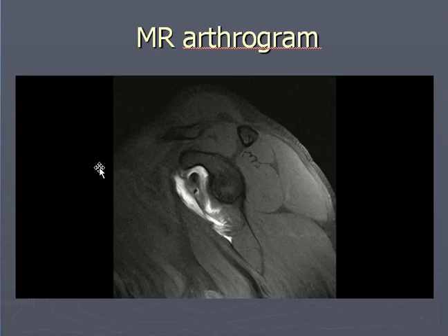MR arthrogram, again we do not need to give any kind of contrast, but the presence of the fluid in the joint space is exploited. Sometimes intra-articular gadolinium is given.